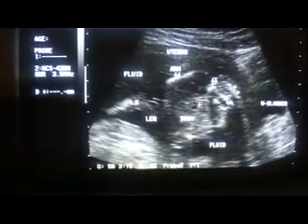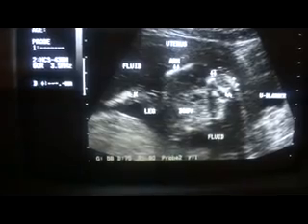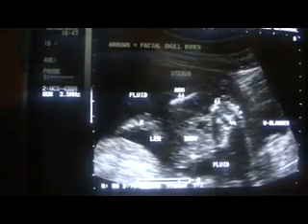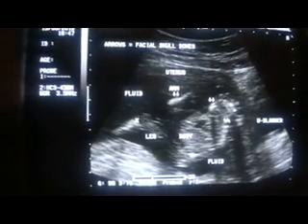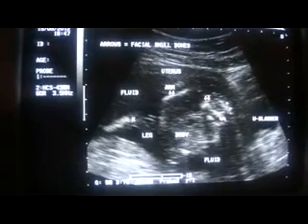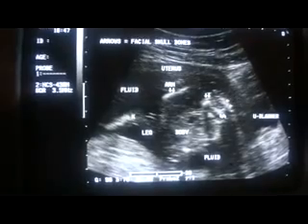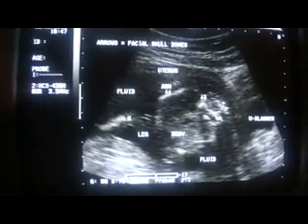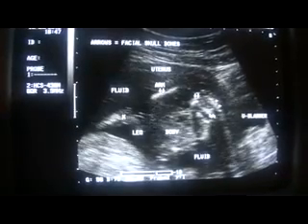But in this case, you are not seeing polyhydramnios. The amount of fluid is normal for the expected gestational age at this stage, and the fetus is really very active in cases of ANENCEPALY.